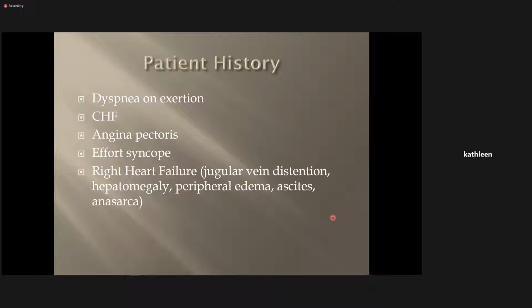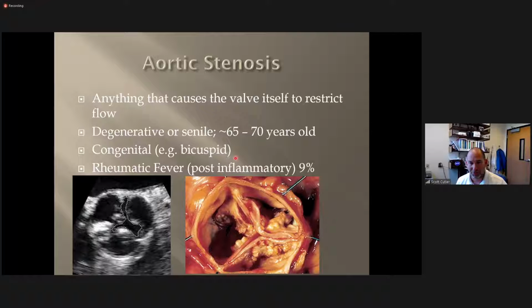Scott, what are we seeing in those photos specifically? Oh yeah, good, sorry. I like to throw pictures up there randomly. So in an echo, we see an aortic valve like this. This is what we call a planimetry measurement, where we're tracing around the residual hole that we perceive. Remember that we get a lot of dropout and shadow, particularly when things get calcified. These are chunky bits of calcification on the valve itself. The valve may also be thickened from what we normally see. So that's how we see it in the echo.